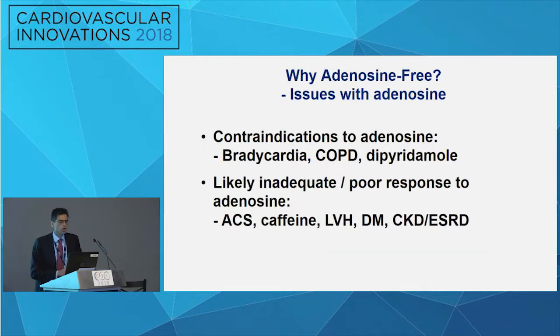And then in terms of the non-hyperemic indices, now I know caffeine is a problem. However, people are NPO, right? So realistically, unless it's an emergency, you're less likely to be doing imaging, and caffeine is less of an issue. But you do have the end-stage renal disease patients, diabetics, LVH, where there are issues with the microvasculature. This may happen.